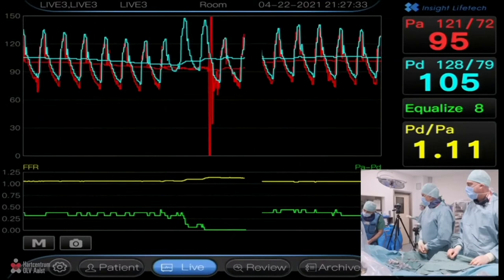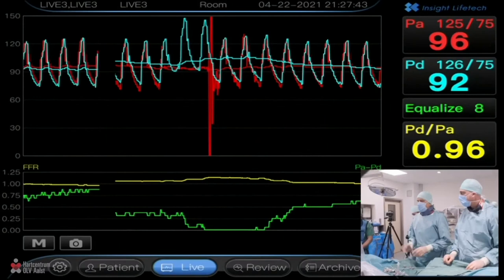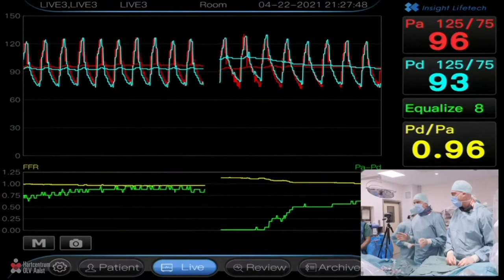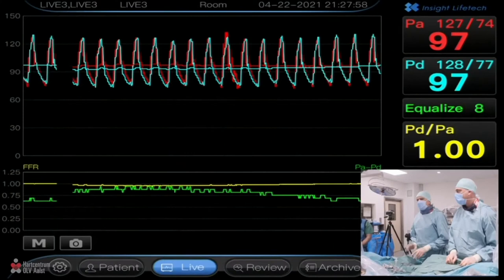And we wait for another 30 seconds to have a nice plateau. You know that papaverine is working for approximately 1 minute with a nice hyperemic plateau of 20 to 30 seconds. That's very comfortable. We advise not to repeat the papaverine injection within 90 to 120 seconds. And Jeroen is already pulling back.